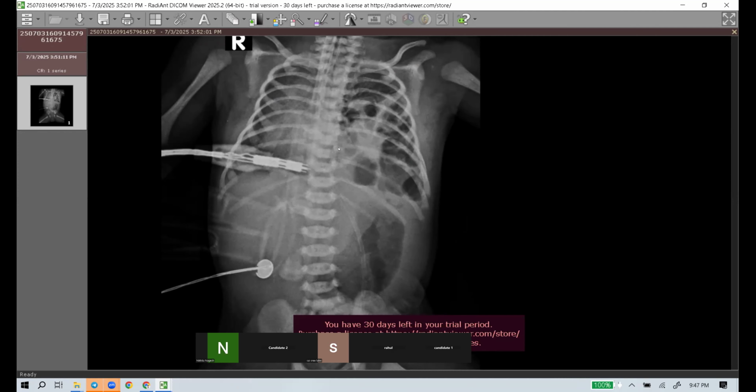start with lines and tubes. So you don't go at the end, and you don't want the examiner to prompt, and they will mark you unsafe if in case the tube is not in position. Because you know all the findings and diagnosis, but it is better you start with lines and tubes so that you don't forget at the end because of all the findings in between.